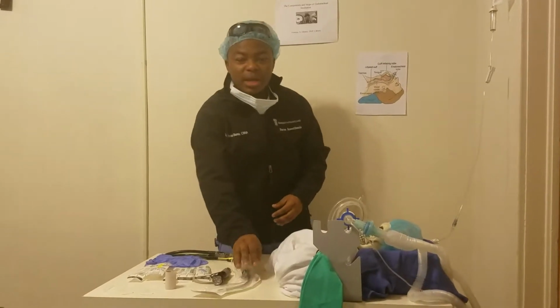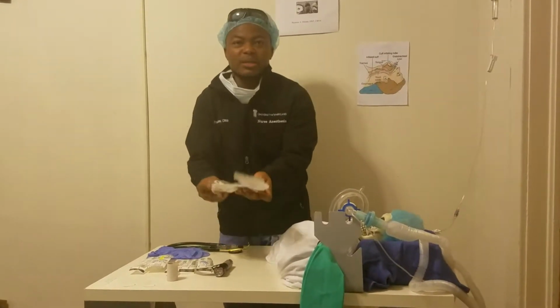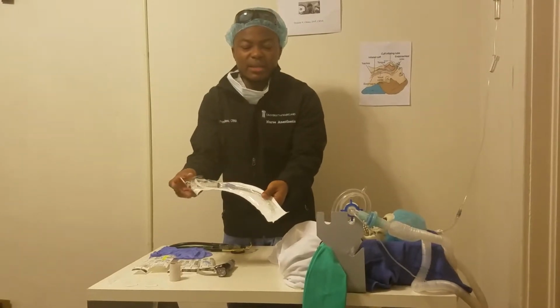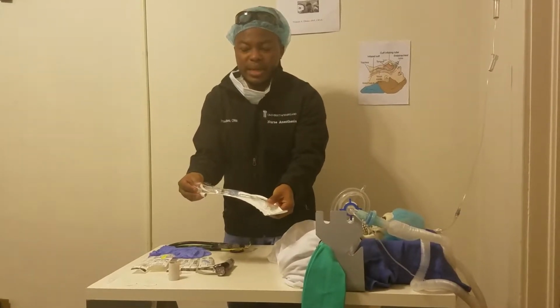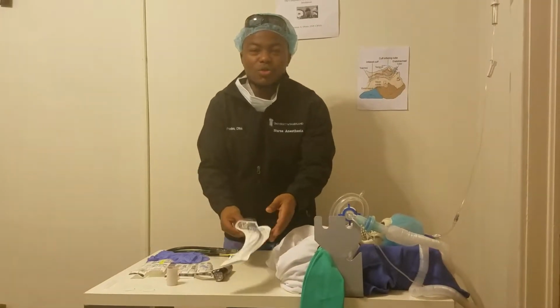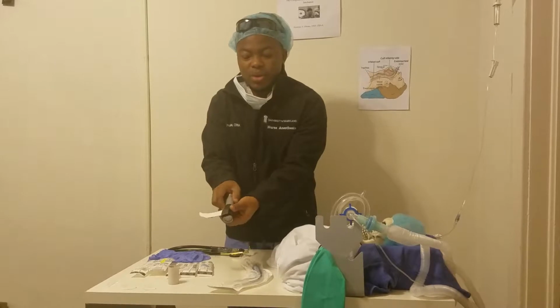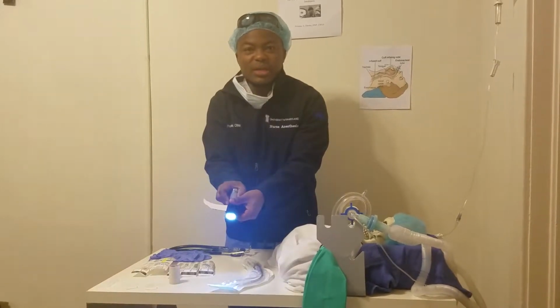We have the endotracheal tube here. This is a 7.0 tube with a syringe connected to it and a stylet, and it also has a bulb at the end that will be inflated once the tube is in place. We have a Mac 3 blade here with a light source that helps us see inside the glottic opening.